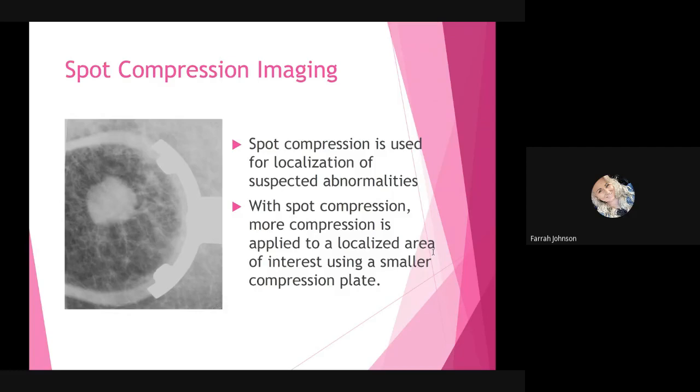So, a spot compression is used for localization of suspected abnormalities. With spot compression, more compression is applied to a localized area of interest using a smaller compression plate. So, here's our actual compression paddle, and here's the lesion that we're trying to look at in greater detail.